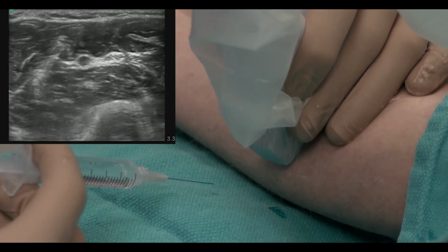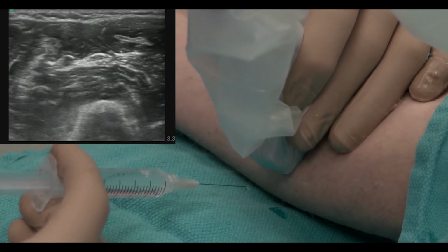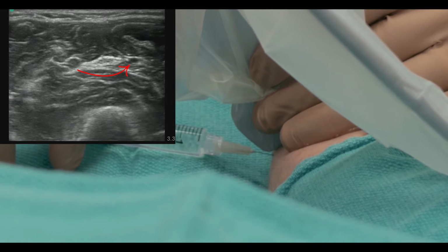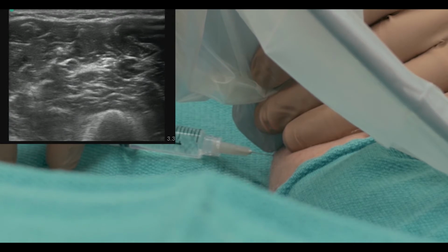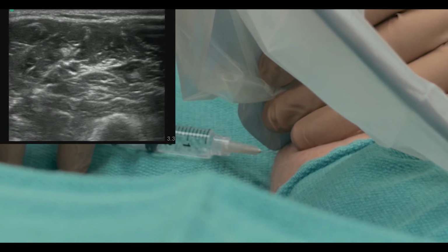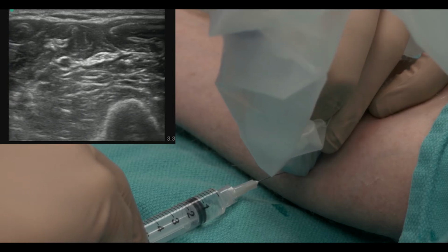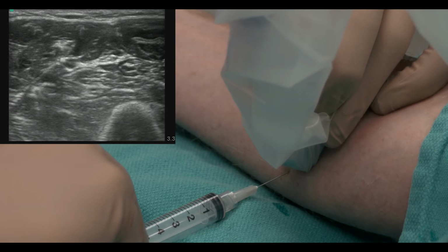It's a bit more superficial and a little bit easier to access than the median nerve. So again, we make sure we're away from the artery. We come in plane again. The needle comes in. Once we're just below the fascial plane, we start to inject. The fluid's going to fill around that nerve. You can get a little bit closer. So we can see that fluid dissecting both above and below the nerve.